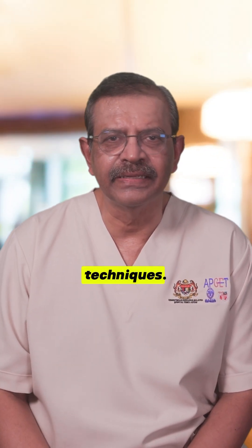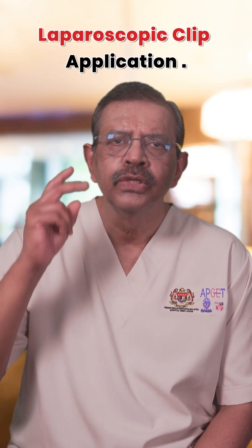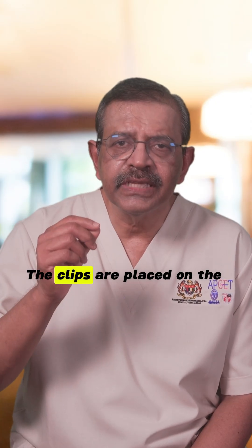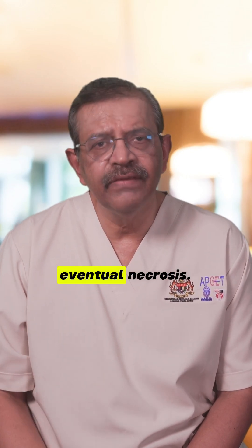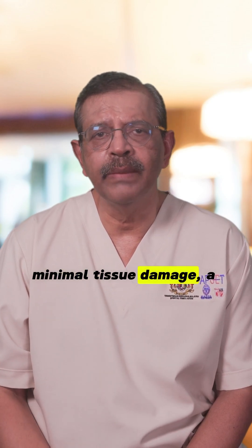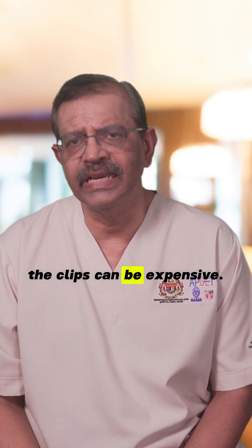Let's explore these techniques. Number 1: Laparoscopic clip application. Two types of clips are used — the Hulka-Clemens clip and the Filshie clip. The clips are placed on the isthmus of the tubes, causing occlusion and eventual necrosis. The advantages are minimal tissue damage, a quick procedure, and high success for future tubal reversal. The disadvantage is that the clips can be expensive.